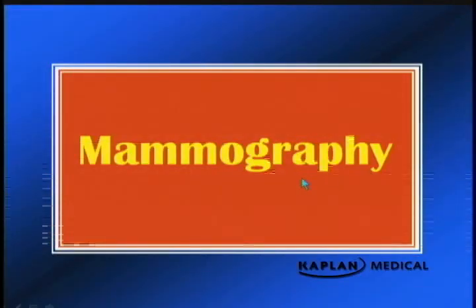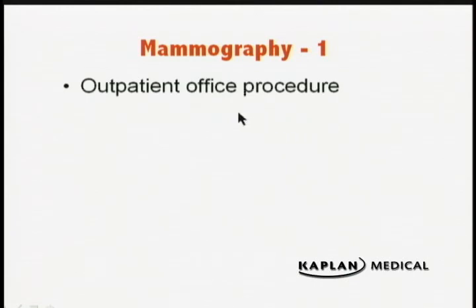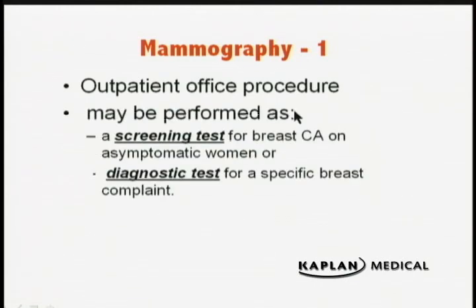Mammography. This is an outpatient office procedure. It is performed by radiology. It can be either a screening test for breast cancer on asymptomatic women, or if a woman has a lesion which is identified by clinical examination, it can also be a diagnostic test.